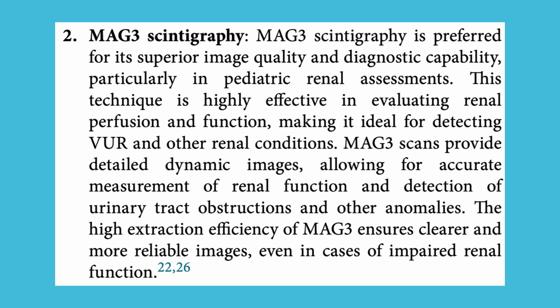2. MAG3 scintigraphy. MAG3 scintigraphy is preferred for its superior image quality and diagnostic capability, particularly in pediatric renal assessments. This technique is highly effective in evaluating renal perfusion and function, making it ideal for detecting VUR and other renal conditions. MAG3 scans provide detailed dynamic images, allowing for accurate measurement of renal function and detection of urinary tract obstructions and other anomalies. The high extraction efficiency of MAG3 ensures clearer and more reliable images, even in cases of impaired renal function.